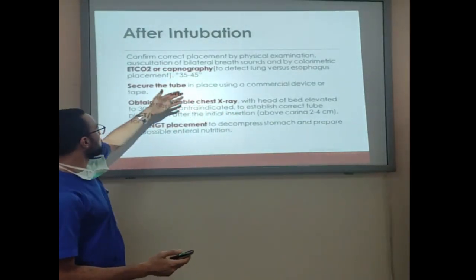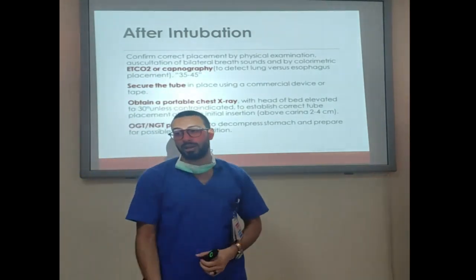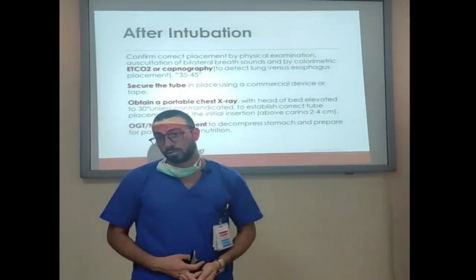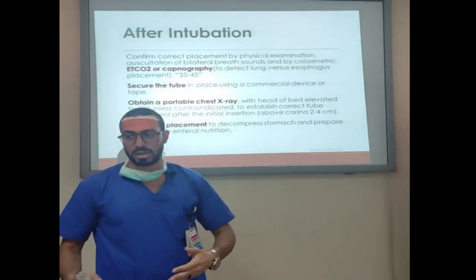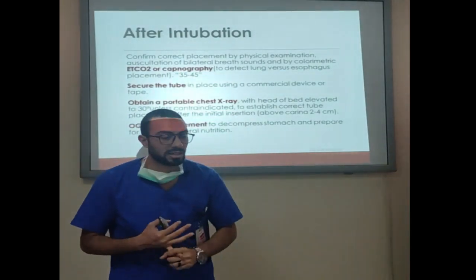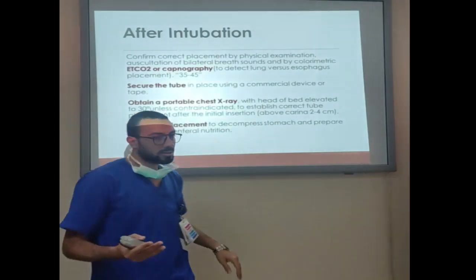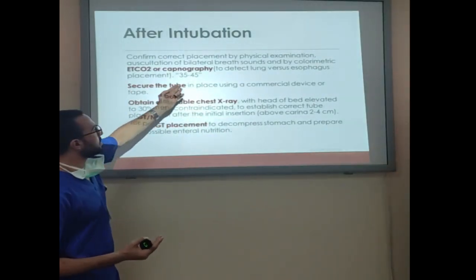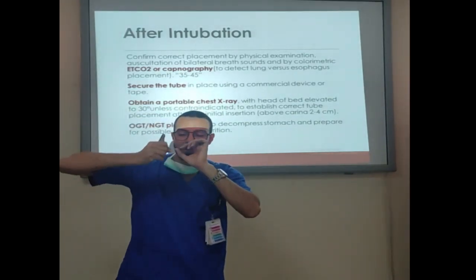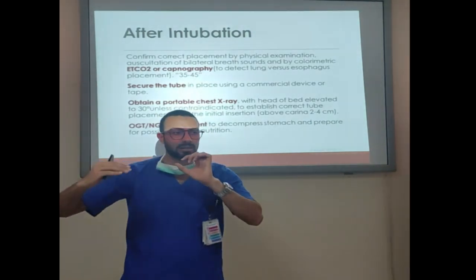After intubation, we should have capnography. Unfortunately, we don't have capnography here with our respiratory therapist, but it's very important to assist the patient all the time, and also it's one of the parameters for weaning, and one of the parameters to be sure that the tube is still inside. So it's important. Anyway, we should have ETCO2. It's a small piece that can connect to the tube itself, then with a small wire to the ventilator to assess the end-tidal CO2.